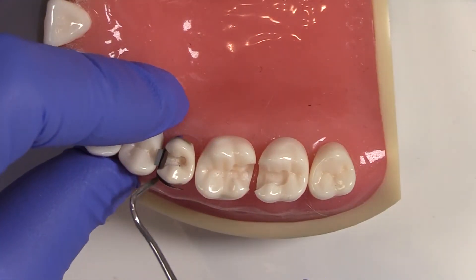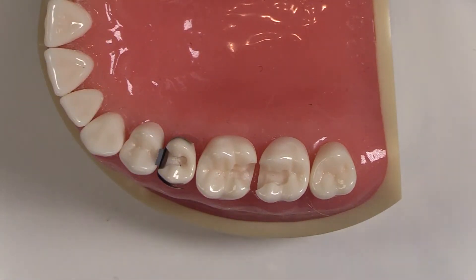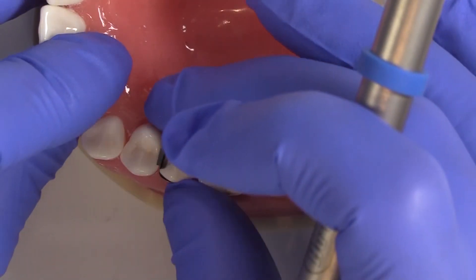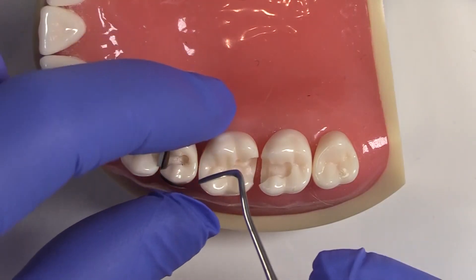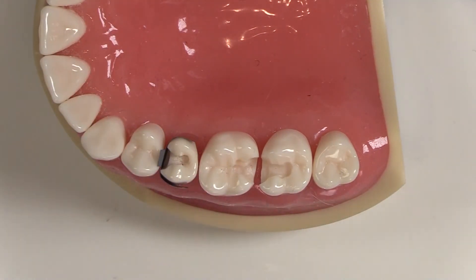Same thing — I like to get it between my rubber dam, so I move the rubber dam out of the way so that when I let go of the rubber dam, it's actually giving a really nice tension there. That way I get a really nice adaptation and very, very low chance of getting any contamination — saliva, anything coming through here.